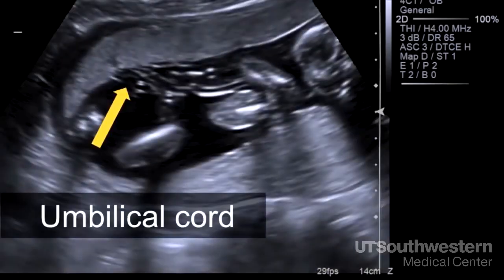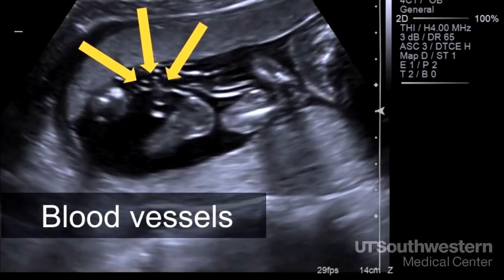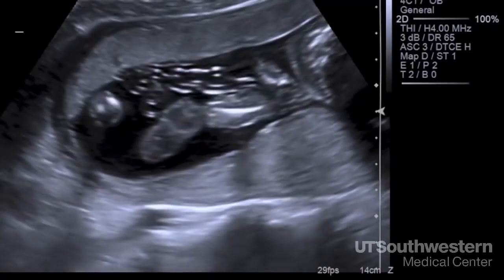This is the umbilical cord connecting to the placenta. We check to make sure the attachment is normal. When we look closely at the umbilical cord, we'll see 2 small black circles and 1 black stripe. Those are the 3 blood vessels in the cord, which is the correct number to have.